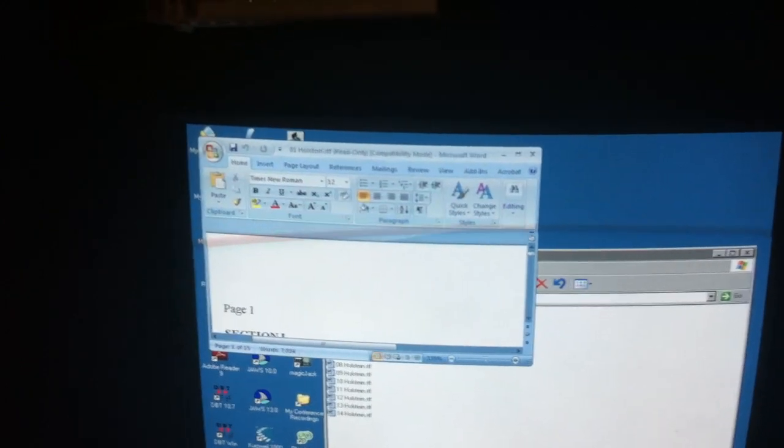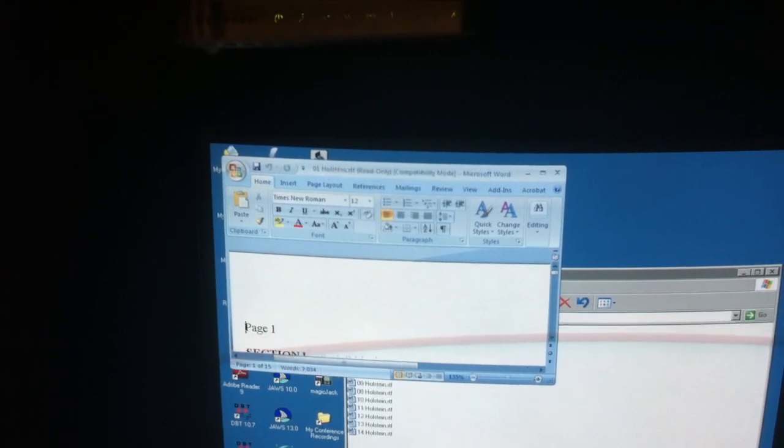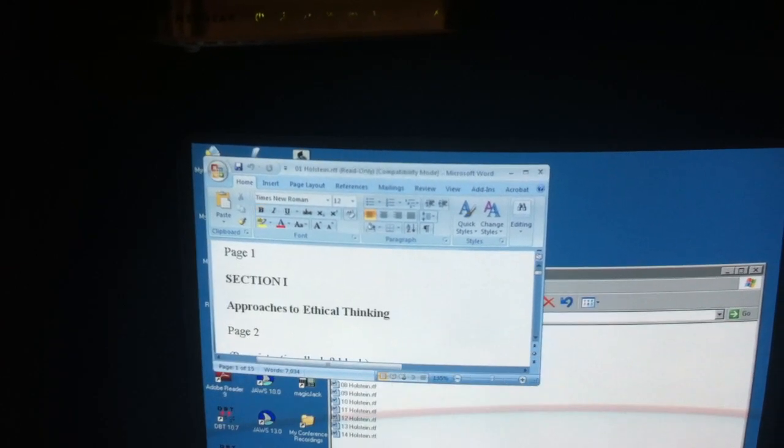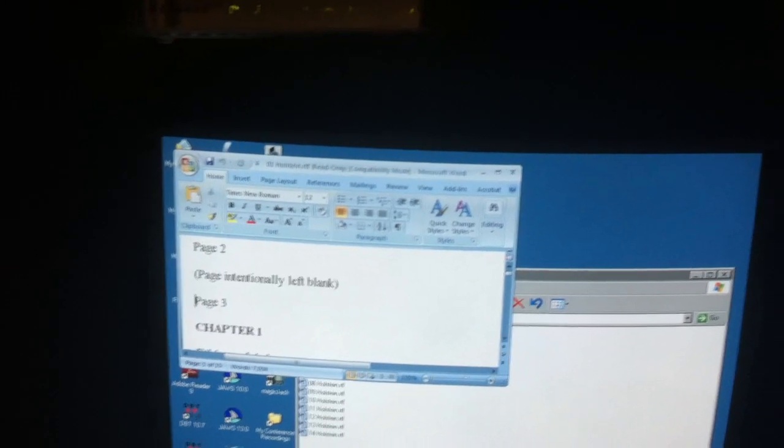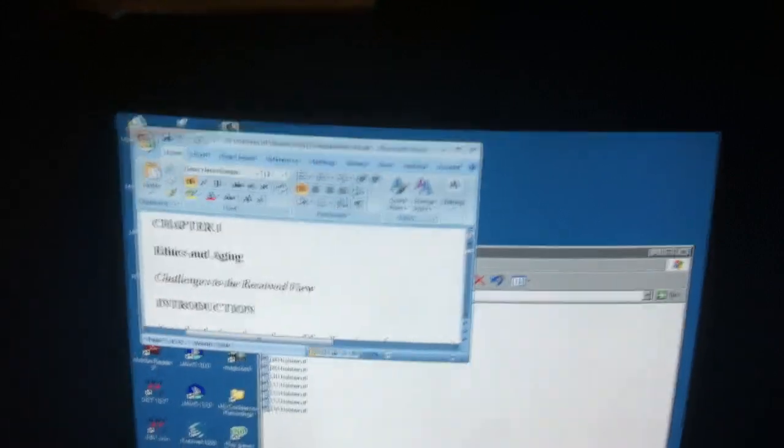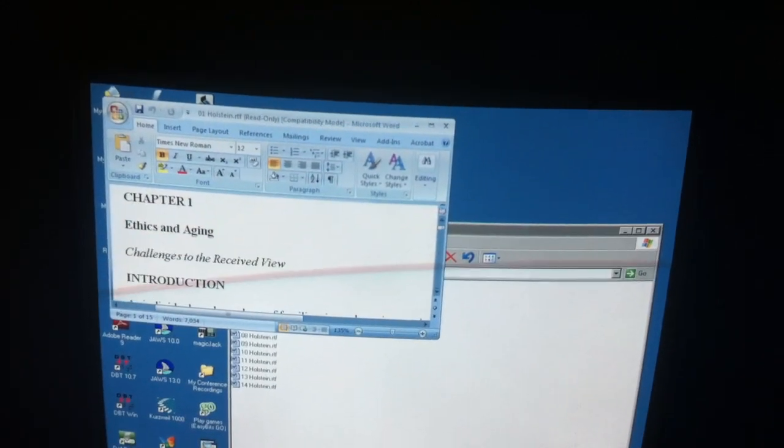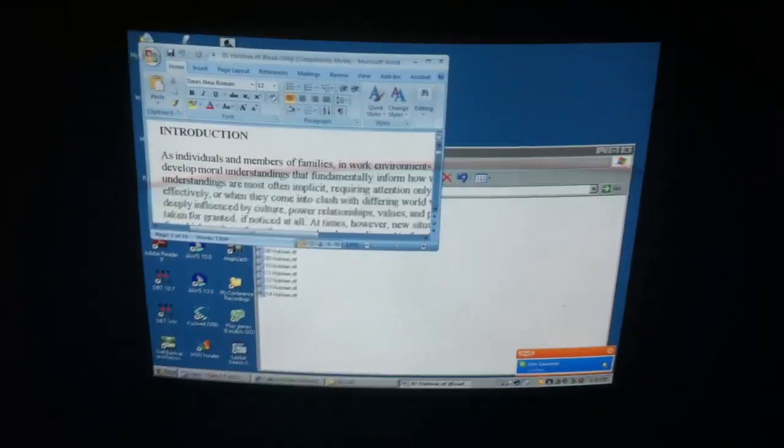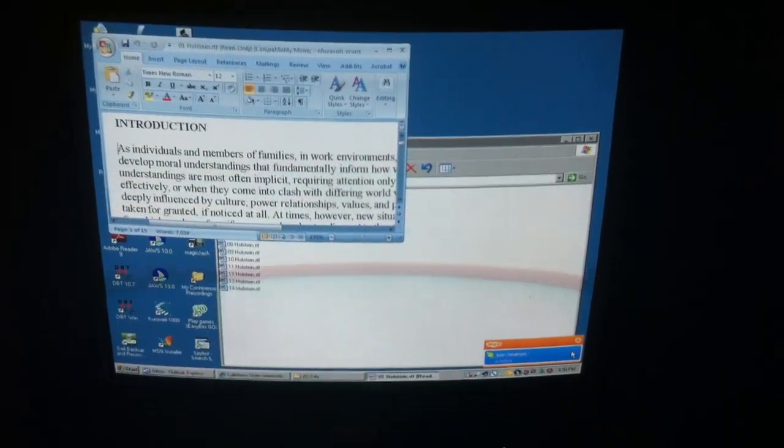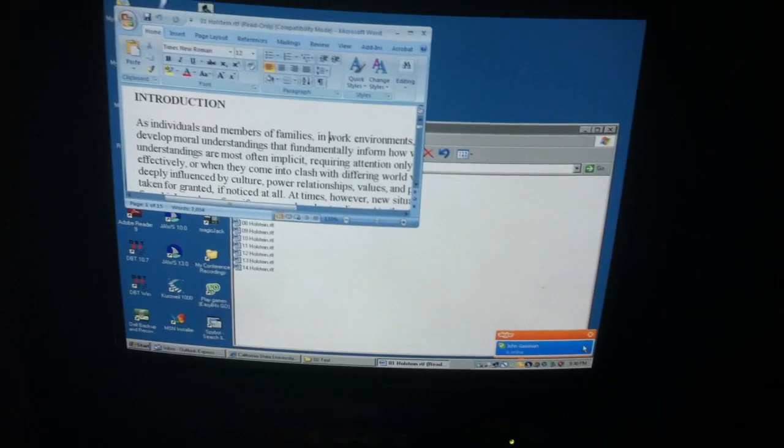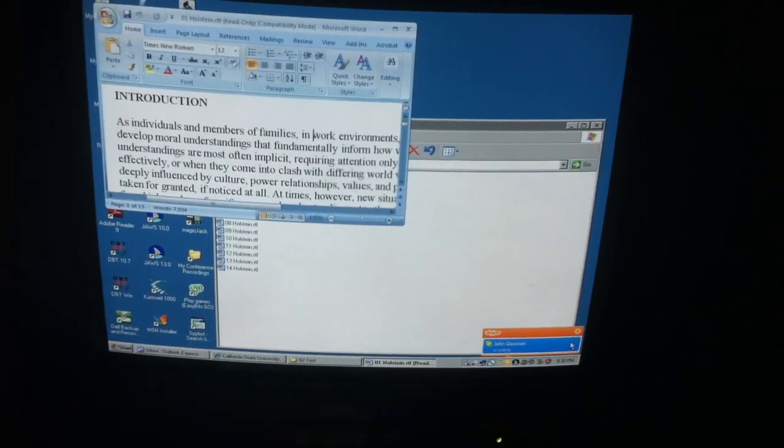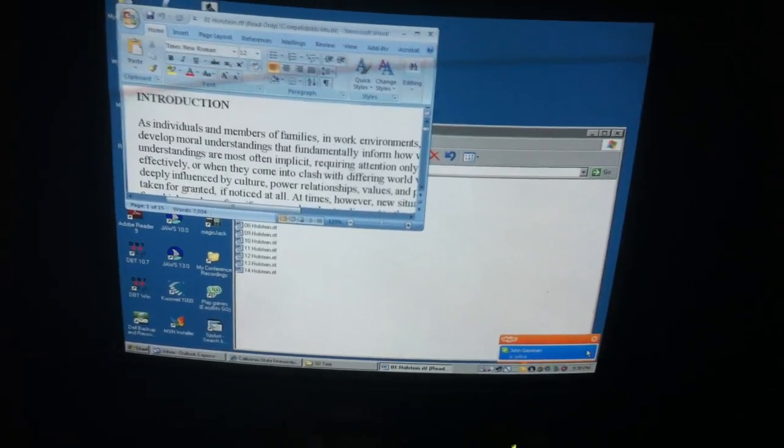So then I use a combination of - one of the combinations to do my reading is Insert 2. Page 1, Section 1, Approaches to ethical thinking, Page 2. And I can make it go slower. Page 2, left paren page intentionally left blank, right paren. Page 3, Chapter 1. Okay, so this is just sounds, and this is how I do my reading. I'll do the Control to stop it.